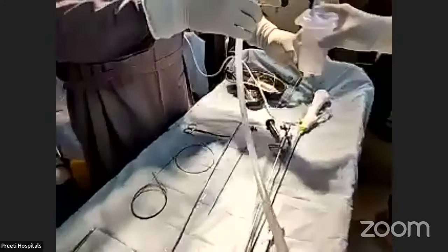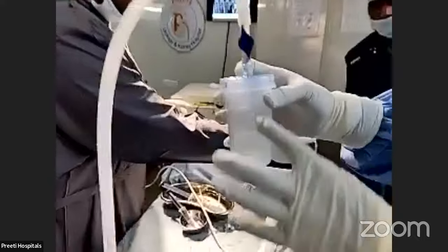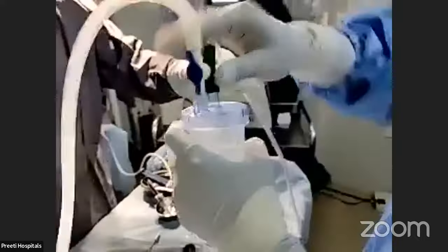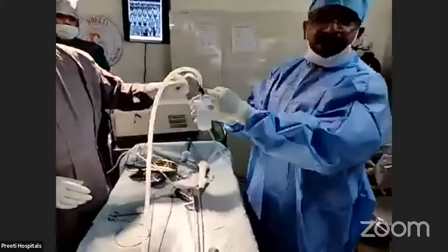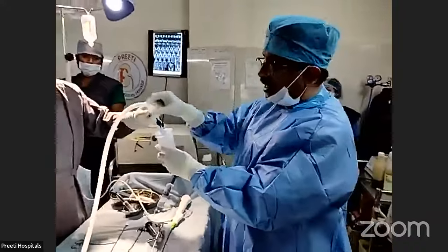This suction goes into this. This has a trap for the stones, so you can put this here and it will go simply to the machine. There is nothing here. Then directly this can go to the machine, but because the stones are trapped, the suction will come here and the water will come into this.